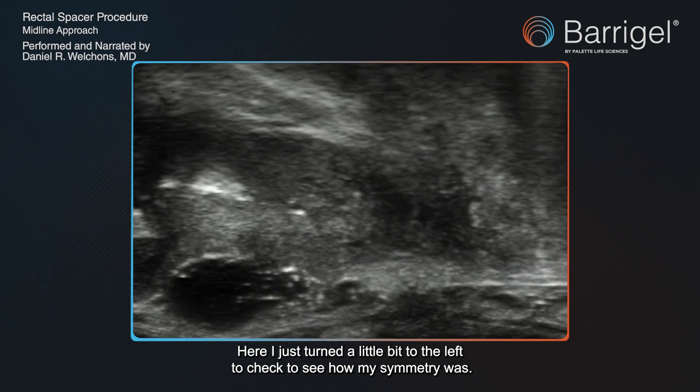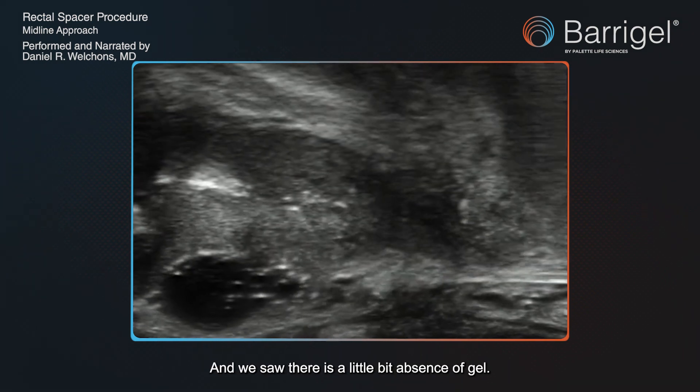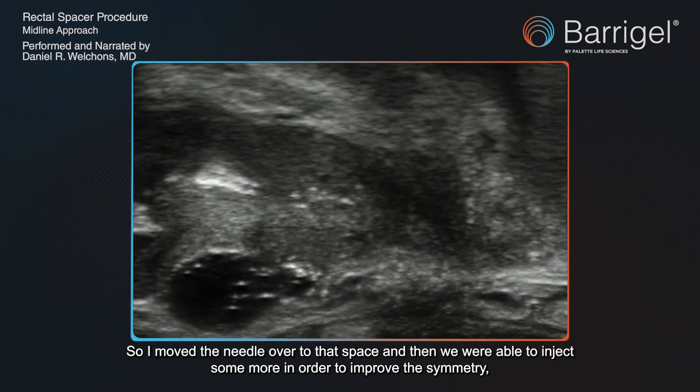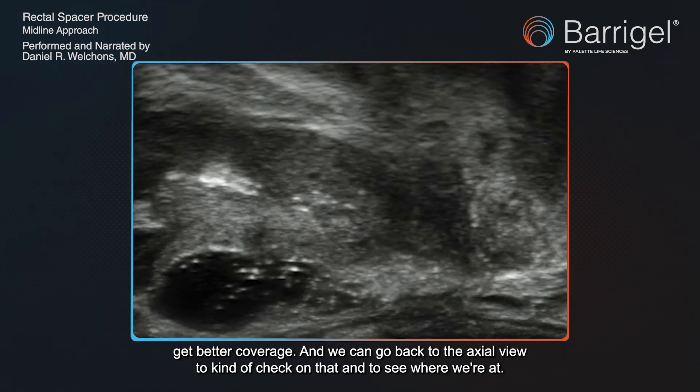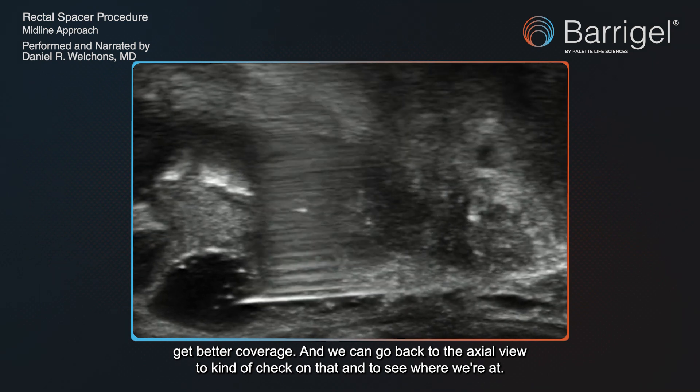Here I turned a little to the left to check my symmetry, and we saw there was a little absence of gel, so I moved the needle over to that space and injected some more to improve the symmetry and get better coverage. Then we go back to the axial view to check on that and see where we're at.